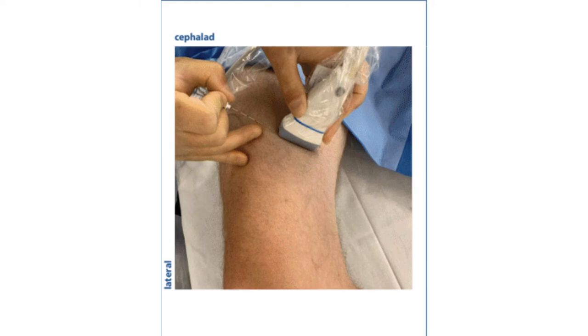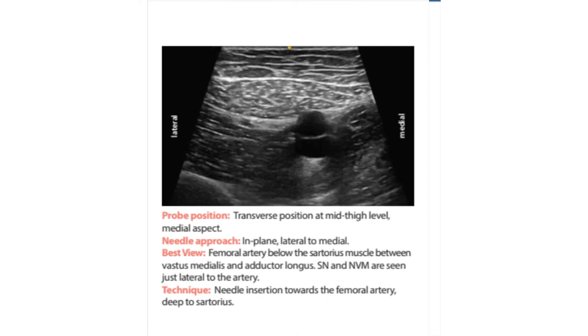The probe should be in a transverse position in the mid thigh towards the medial aspect. This is the ultrasound image we hope to achieve. Our needle approach is in plane, lateral to medial.